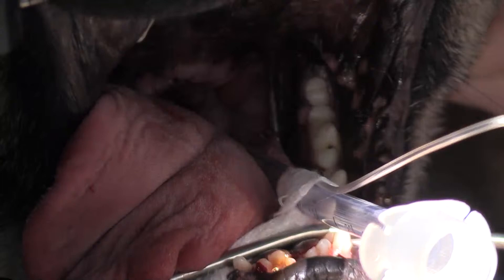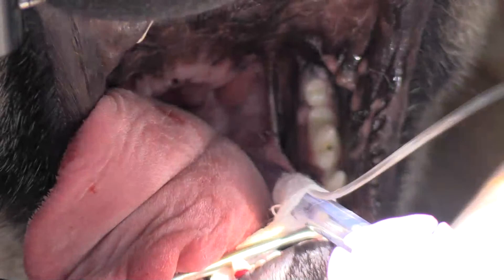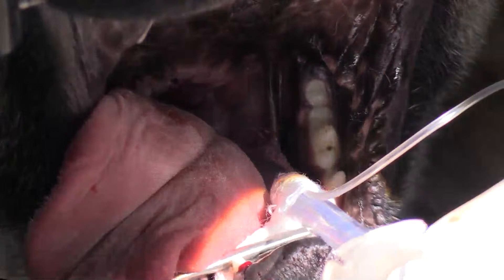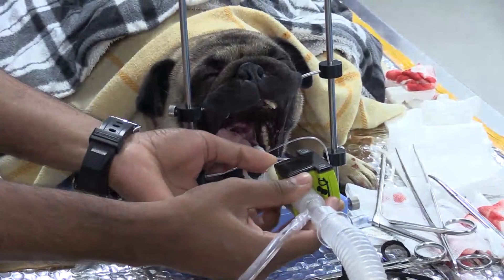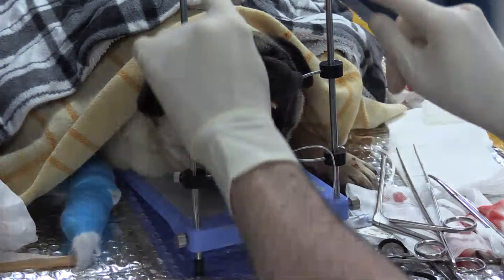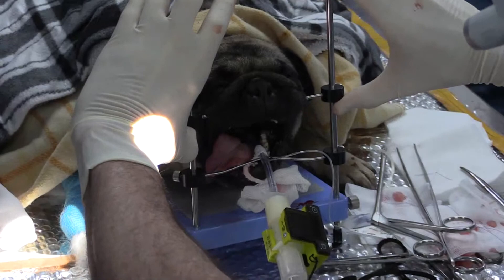Before I release the dog from the head brace I'll zoom out so you can see it. It's made by a company called IM3 — it's actually made for holding rabbit mouths open for dentals, but it works really well. I tried it at a brachycephalic airway surgery course and thought it was fantastic. You've got this blue brace with two bars coming up on either side and adjustable mouth pieces that you can move up and down. I've also used it for brain surgery.